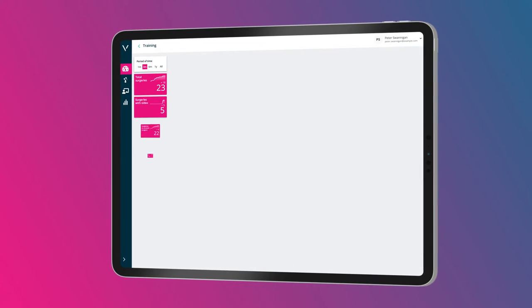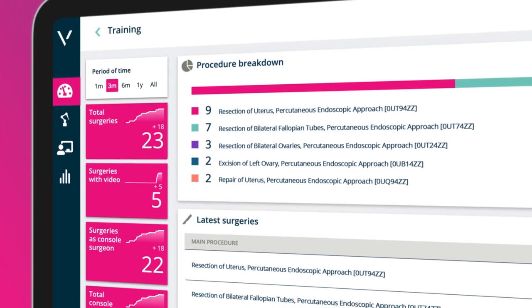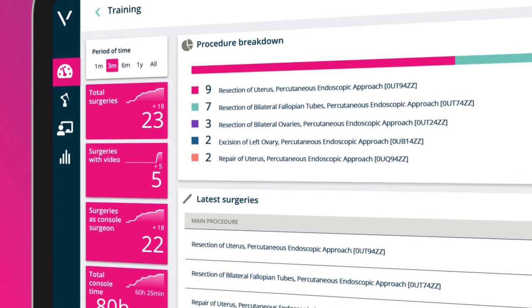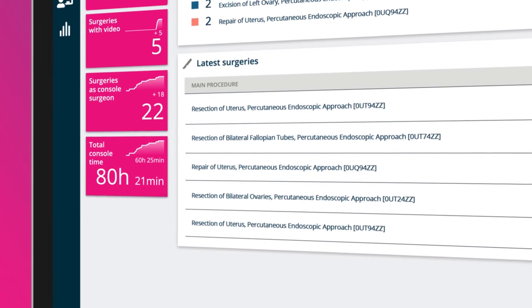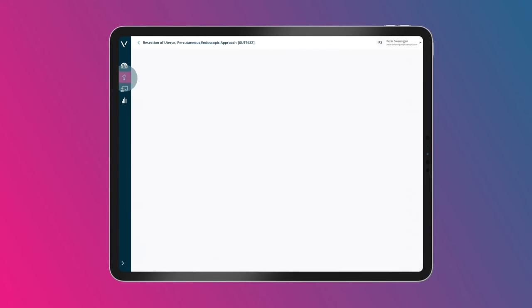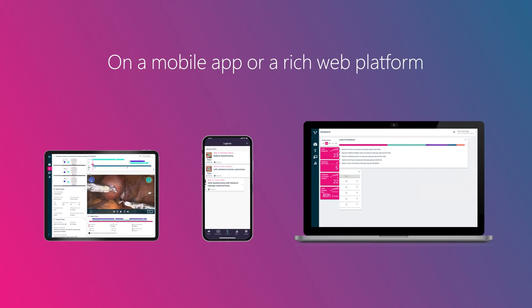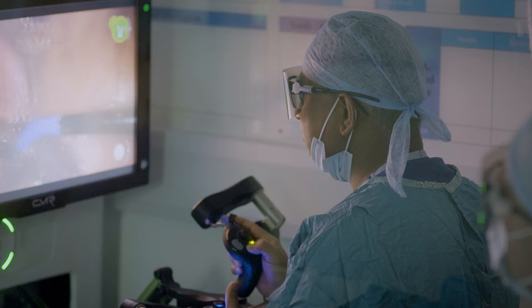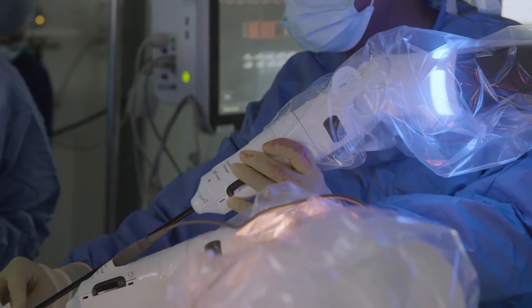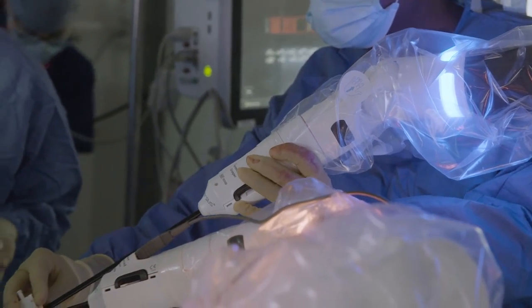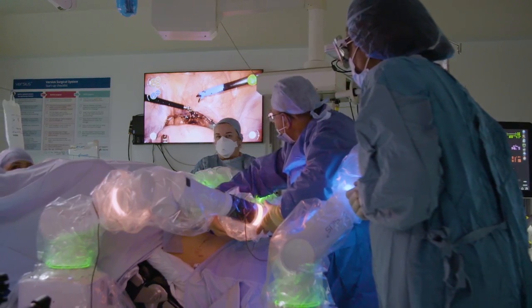With an easy to navigate and personalized user interface, you can view key insights from all your Versius cases in one place — on a mobile app or on a rich web platform. Versius Connect gives you the data you need, empowering you to do what you do best: delivering high quality surgical care.